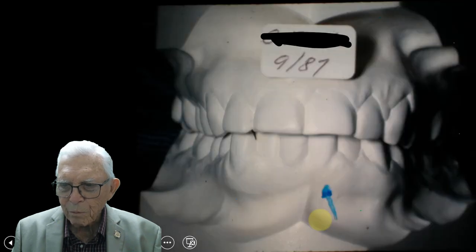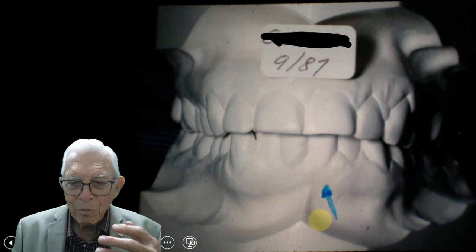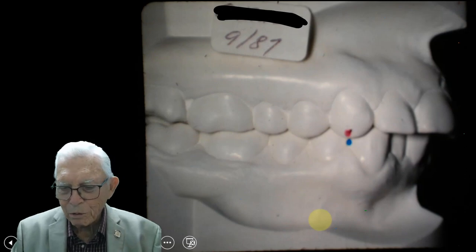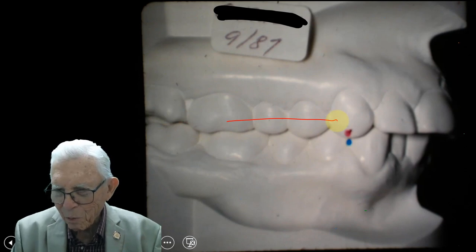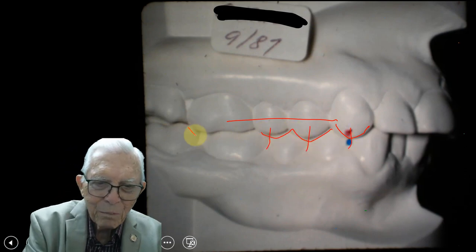Let's get started on this case and show you some really good things you can do with this Big Daddy Arch. This lady worked for me for several years and learned orthodontics, and she wanted to get her teeth brought back in. She also had a temporomandibular joint problem. Now, the right side of the mouth is correct — this is a Class I. These teeth are going right in the right spot, it's even got the six keys of occlusion.